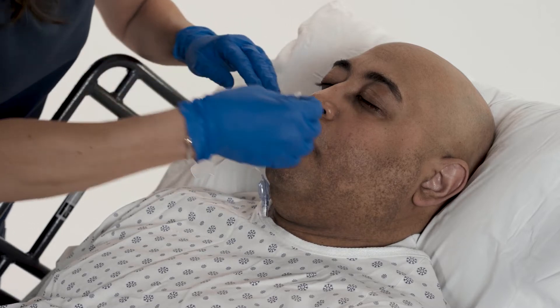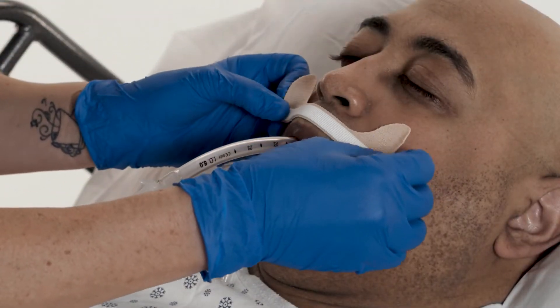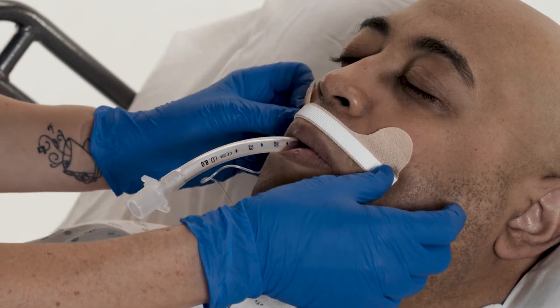Apply provided skin prep. With tabs up, apply the adhesive base above the upper lip.